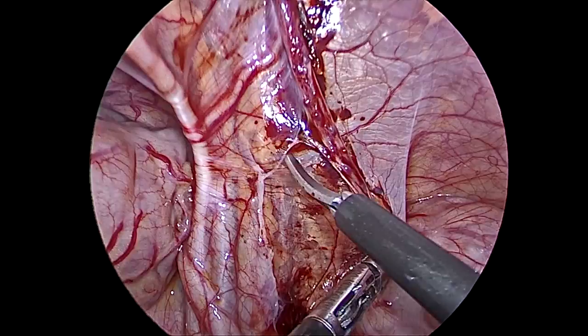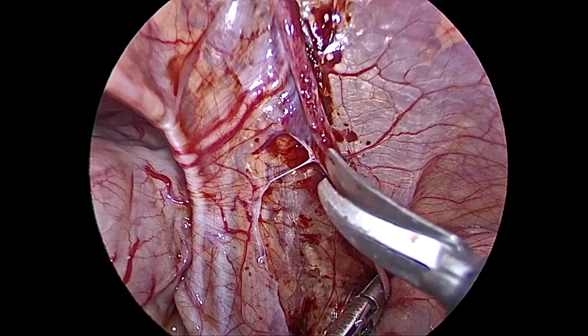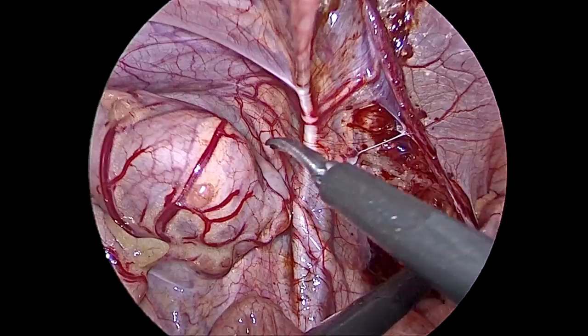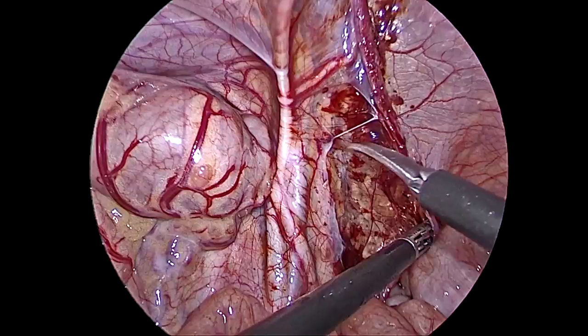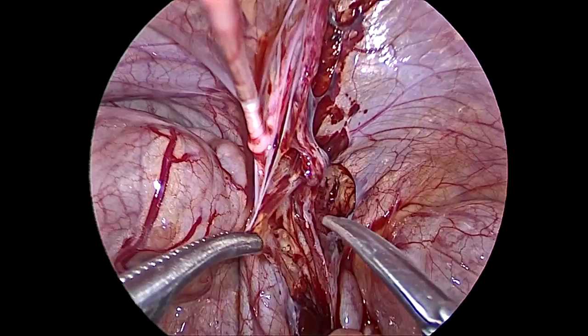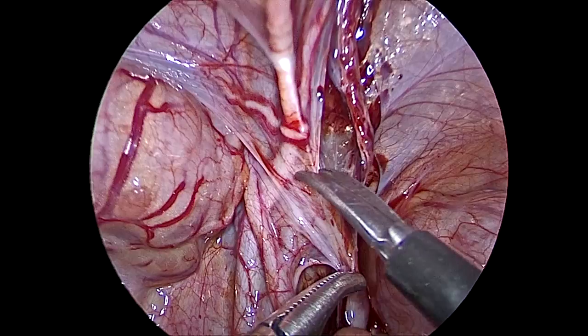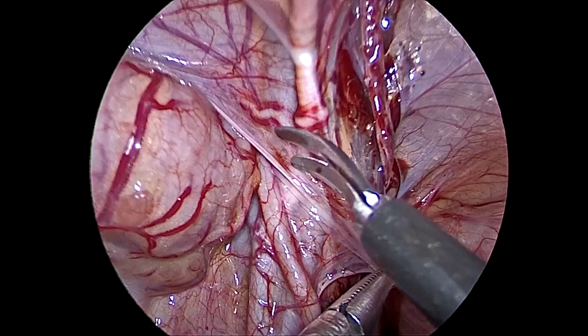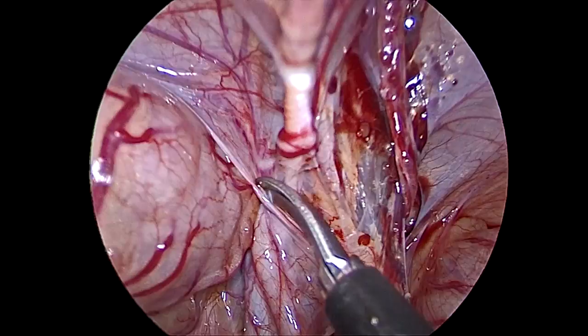Slowly we are going towards the gonadal vessels. You can see the vas here clearly. We will cut the peritoneum along the direction of the vas. This is the sigmoid colon and the vas going behind the bladder — along like that we will cut. Now we will pull the peritoneum and cut slowly below the vas. A fine scissors is essential. Care must be taken that the vas should not be cut. This surgery should be done slowly — even then, this surgery was finished in less than 50 minutes.